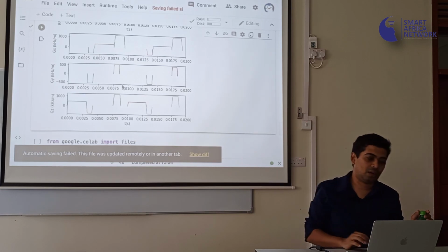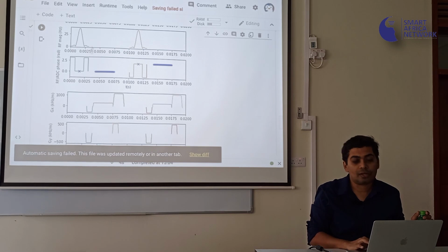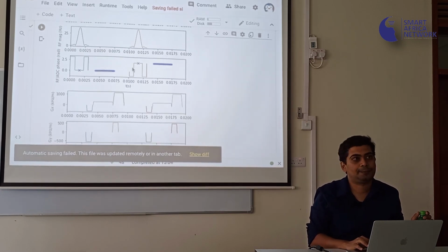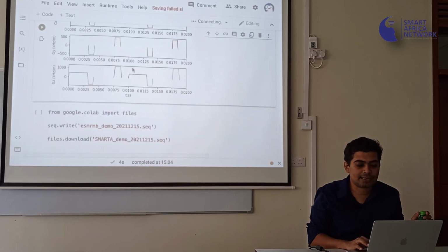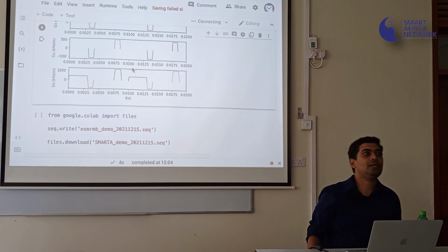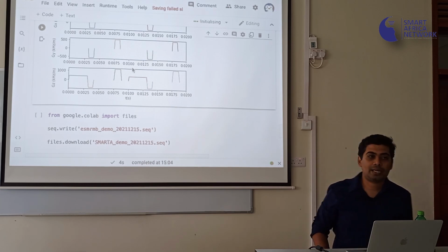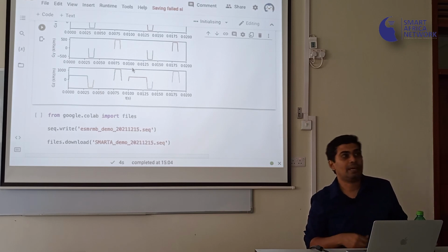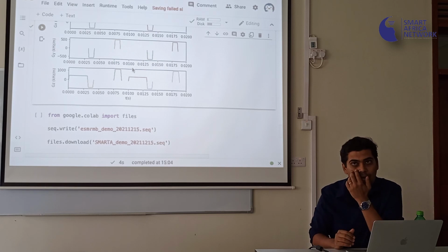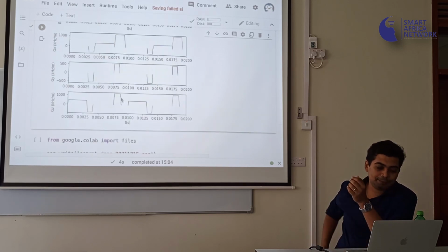With this you can change the order of these events and the shape of these pulses, based on your understanding of MR physics downstream. When you play the virtual tabletop games, you should be able to identify what I should do to the sequence to make different things happen on the hardware downstairs. So this is like controlling the hardware using this Google Colab. Now, how do I?